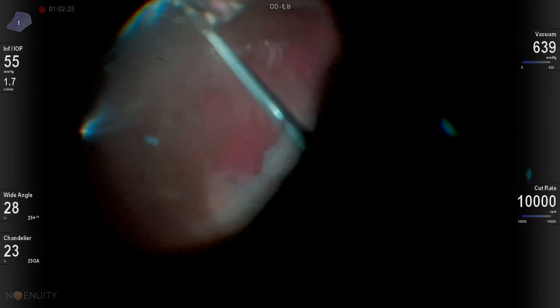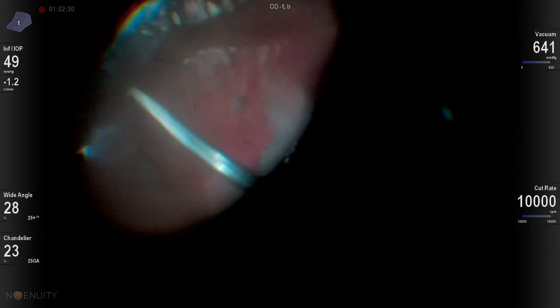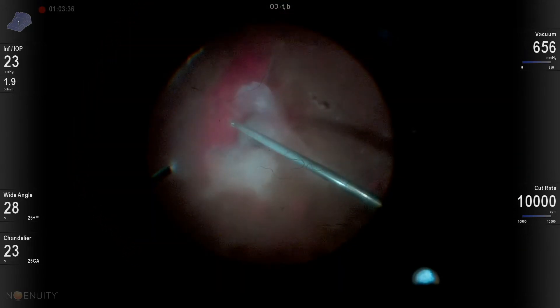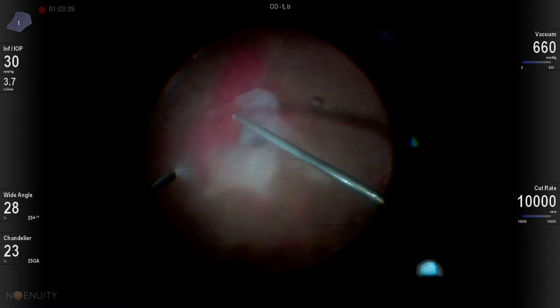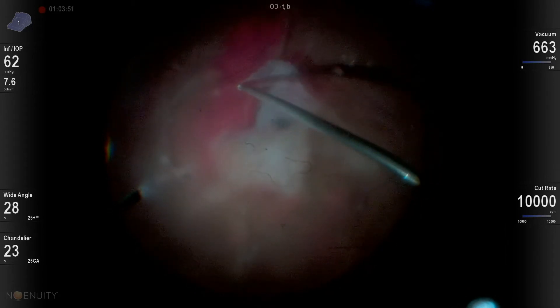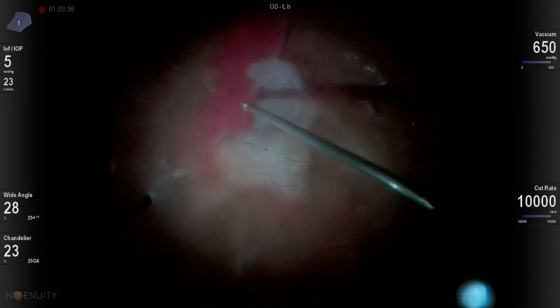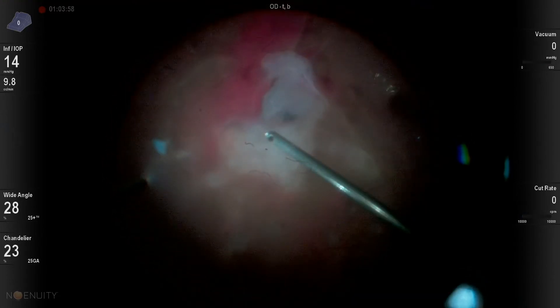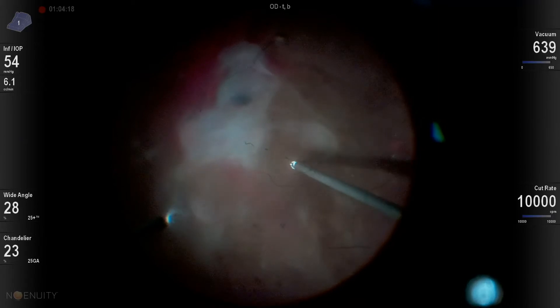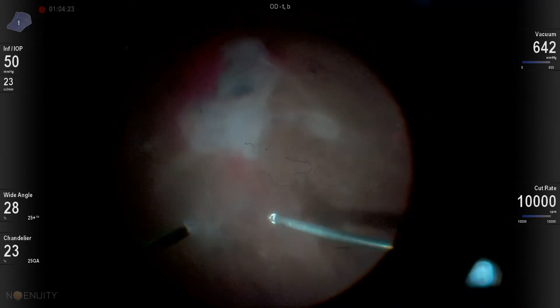I would start most of these diabetic TRDs by basically dissecting away any anterior vitreous traction from the posterior traction. This gets me comfortable in the eye, helps me get a feel for how the patient's going to do, lets the patient wake up a little from anesthesia, and gives me time to think about how we're going to attack this plaque. It also decreases any peripheral traction, and most of the time the mid-peripheral vitreous will be lifted up. Once I've got most of that lifted up, I'll start to work on the back of the eye.